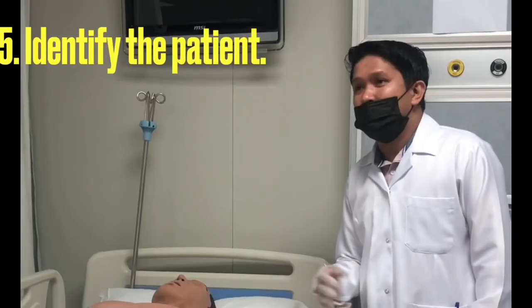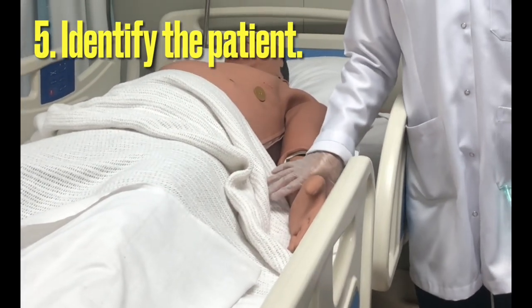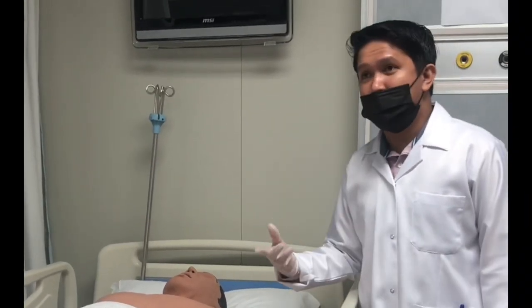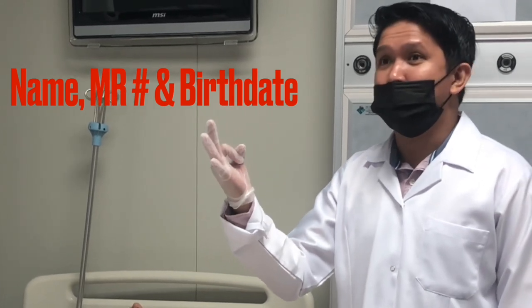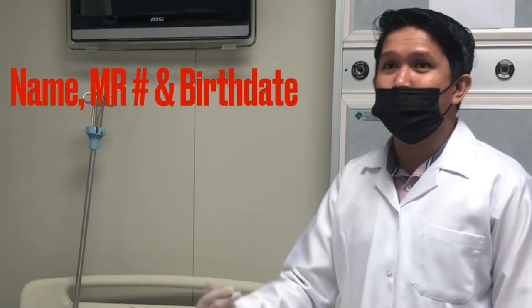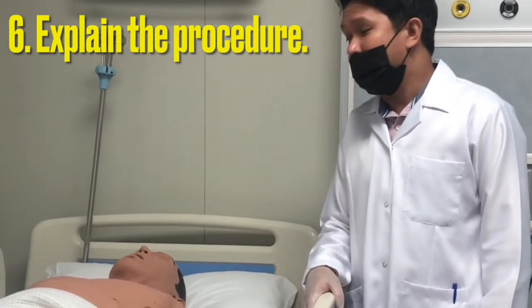Step number five is to identify the patient. Ask: 'Patient, can you please tell me your name?' Check the medical record number on the patient's ID band, and ask the patient's birthday. These are the three identifiers: the patient's name, the medical record number, and the patient's birth date. You need to identify the patient using two out of three identifiers.